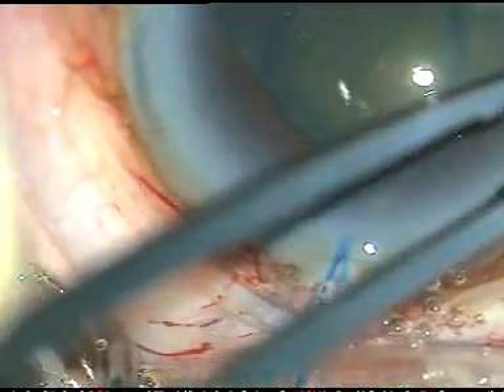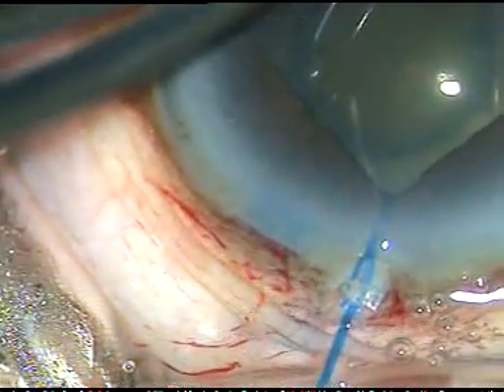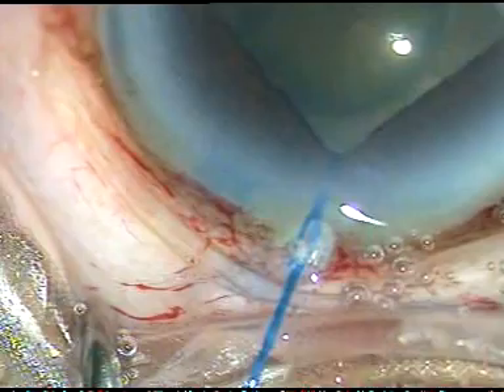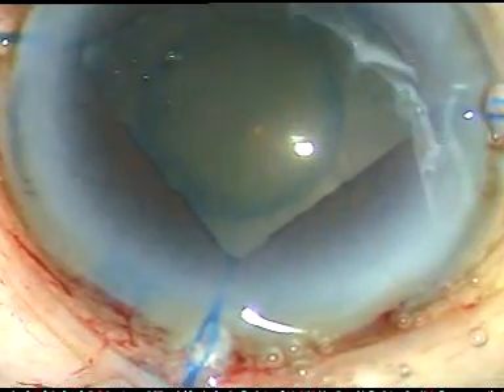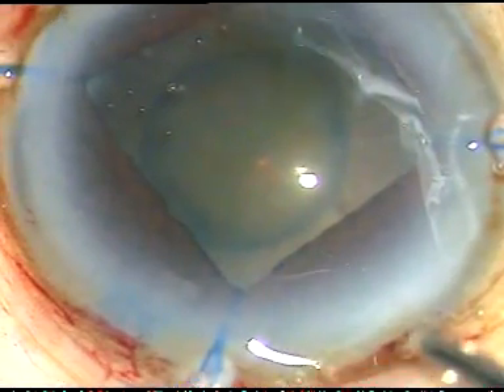Pull the hooks and see how much dilatation you can get. In this case, the pupil has been dilated very well — about 6.5 to 7 millimeters.